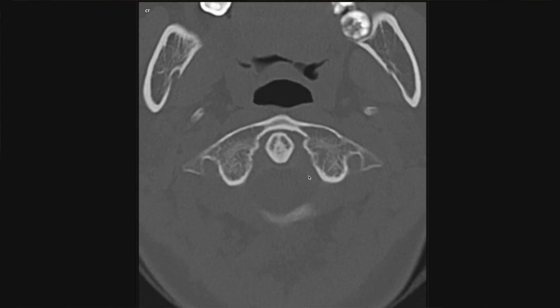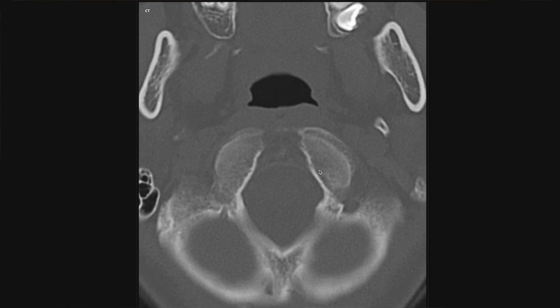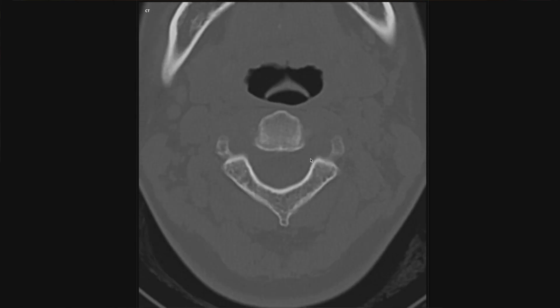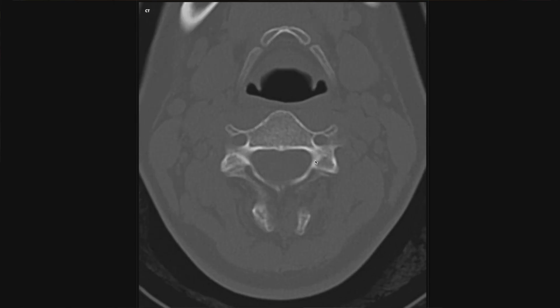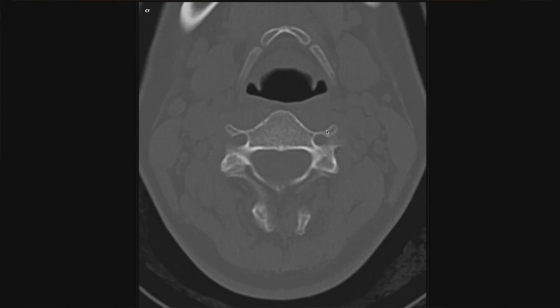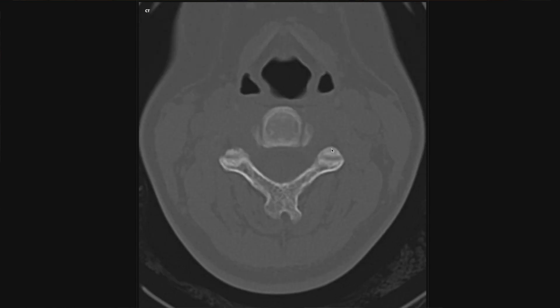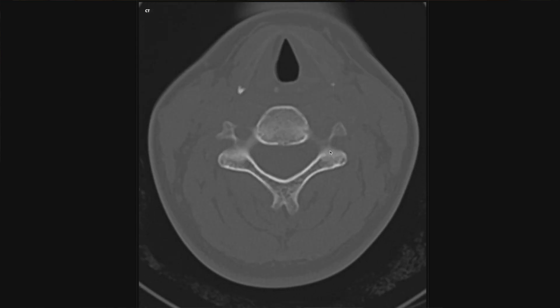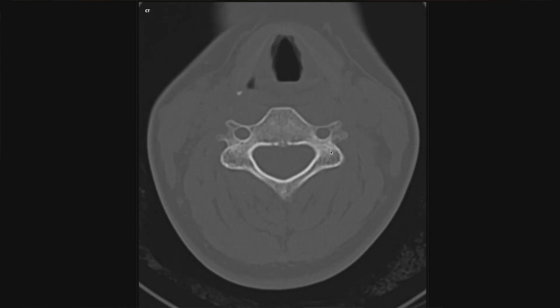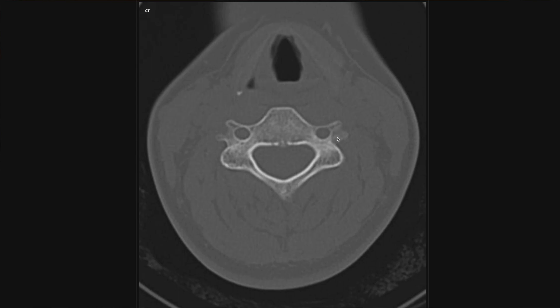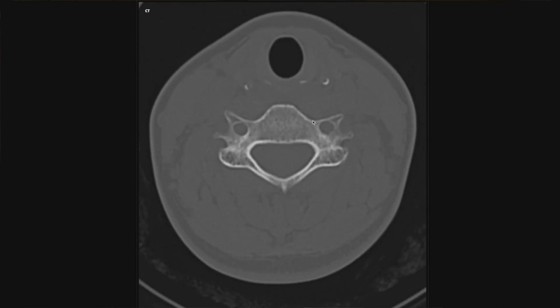I then switch to the axial view and scroll up and down the cervical spine multiple times looking for fractures. I pay particular attention to the transverse foramen, which is where the vertebral artery runs. Any injury or fracture to this area, you have to worry about vertebral artery injury, which can be catastrophic and can lead to vertebral artery dissection. So I'm looking carefully at the transverse foramen.